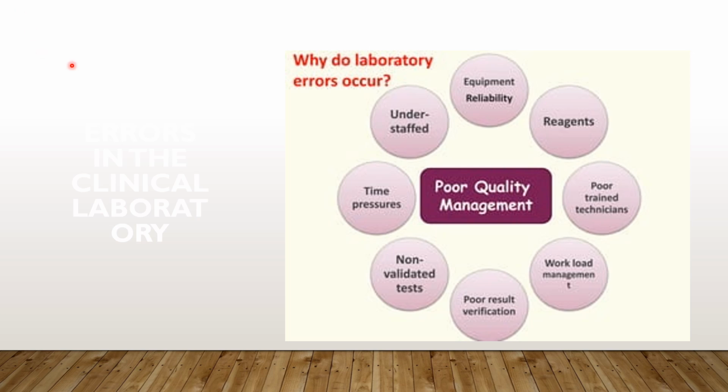So let's talk about the different laboratory causes which lead to errors. They can be understaffing, if appropriate staff is not available and there is a work burden. Then equipment reliability is the second important component.